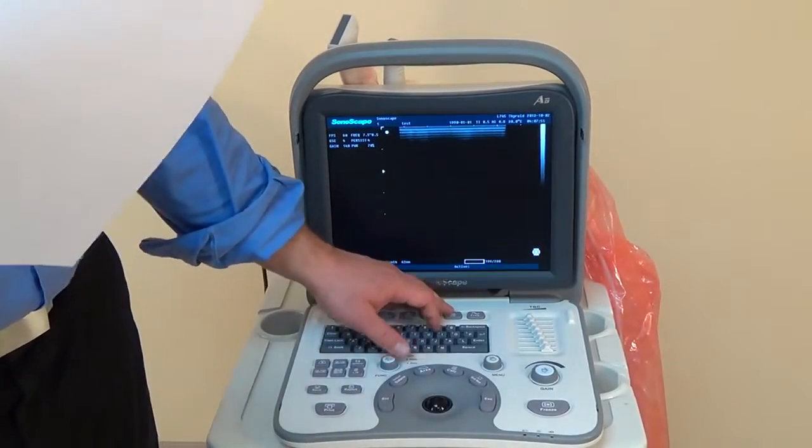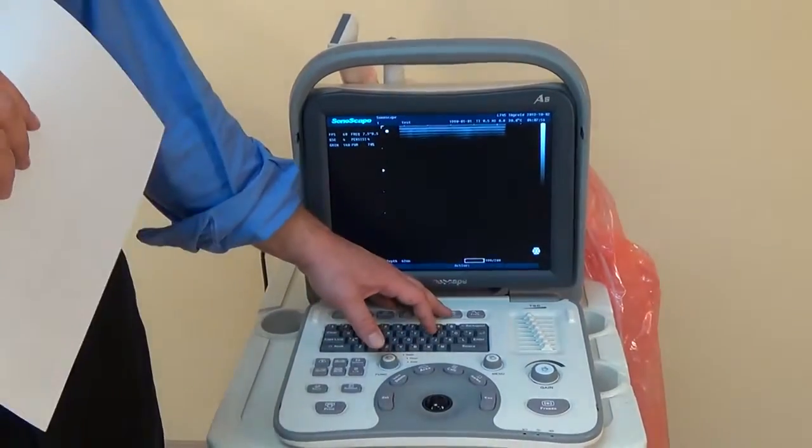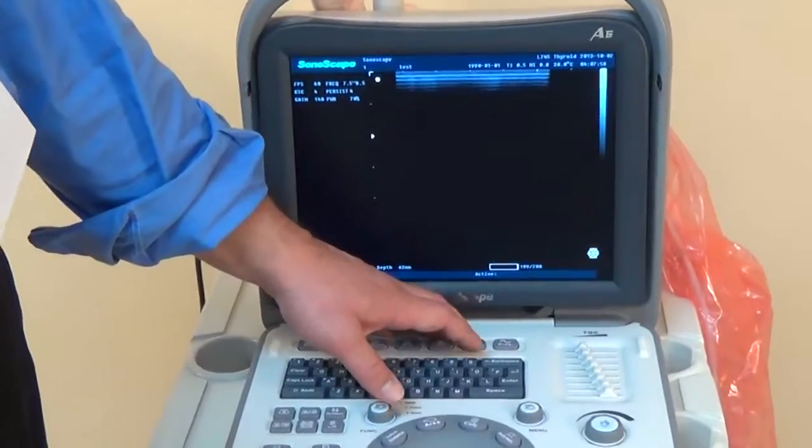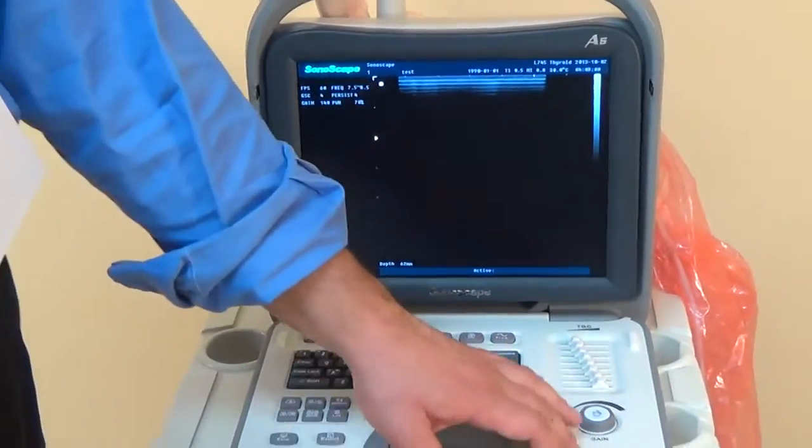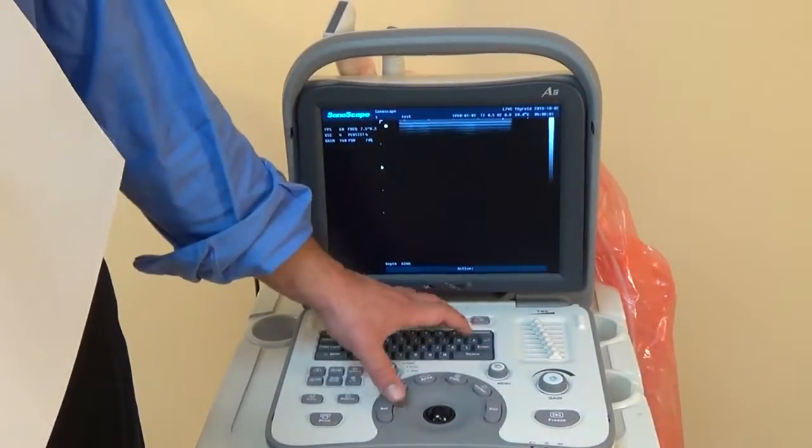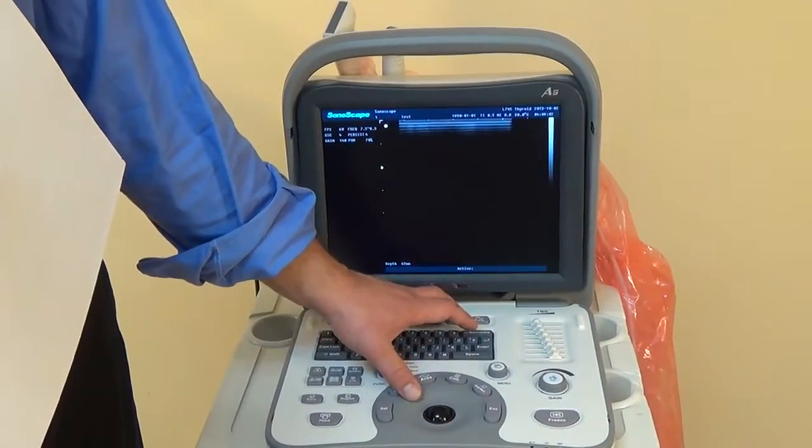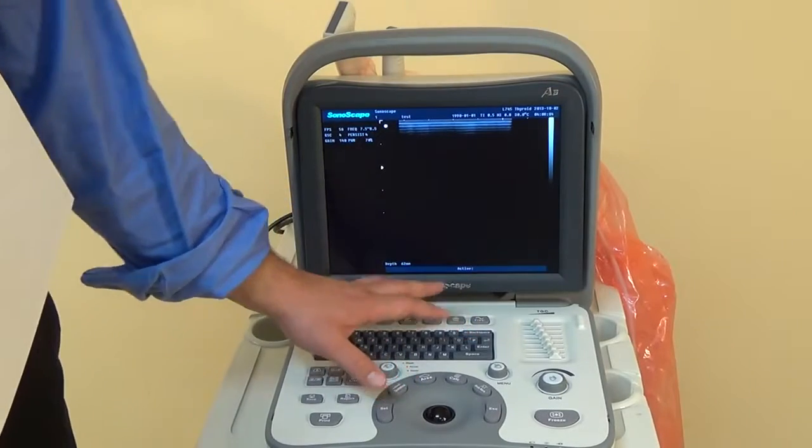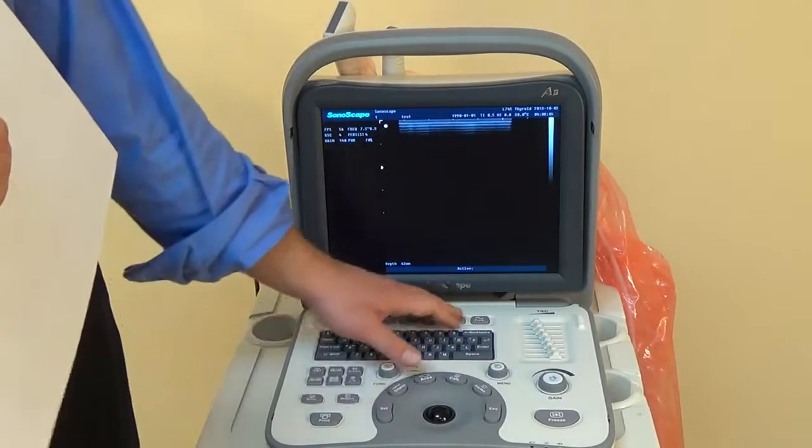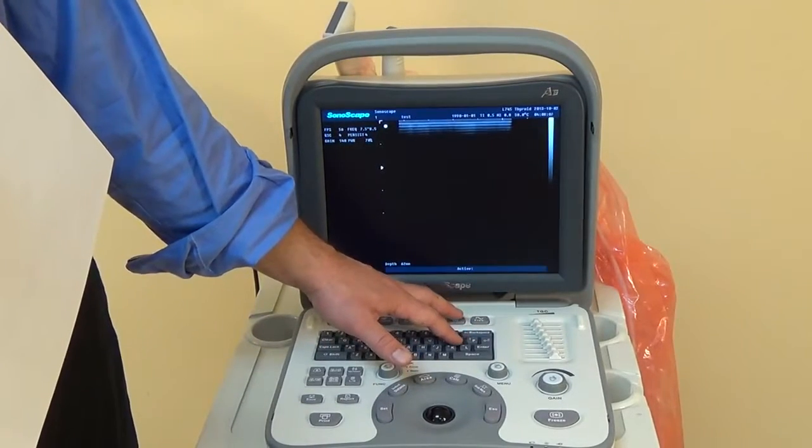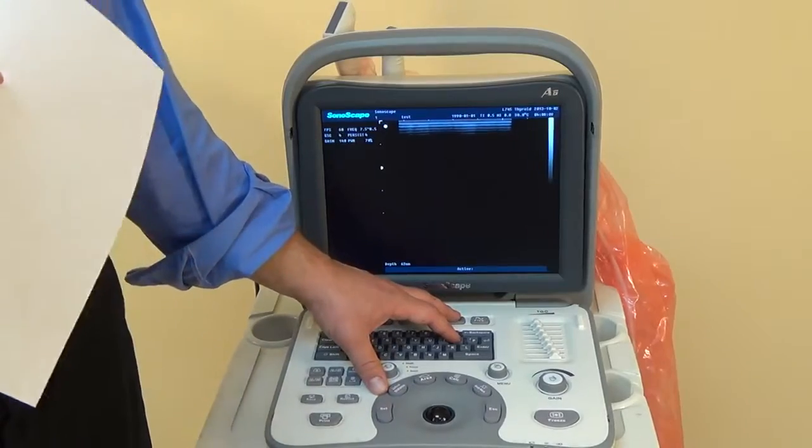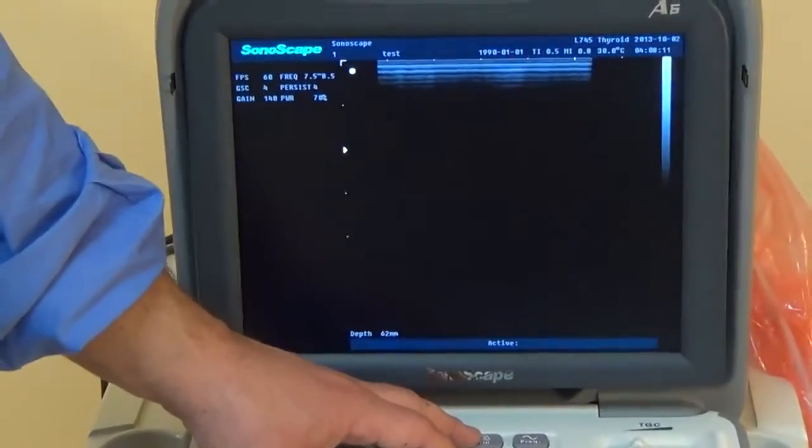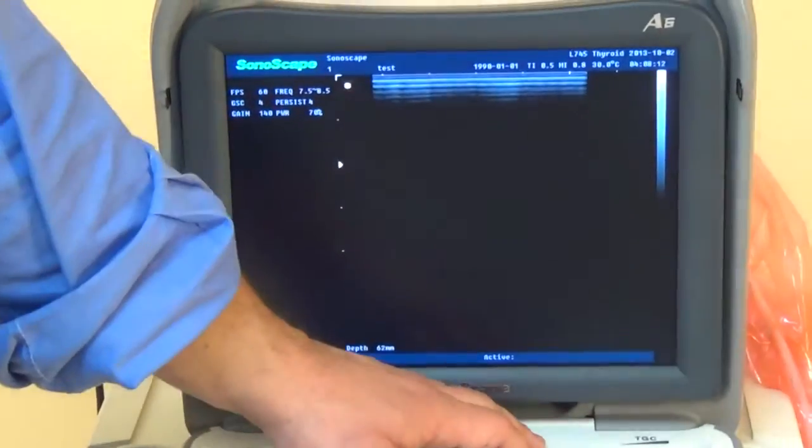The THI button is for tissue harmonics. So that's something that not everybody will be using a lot. It just adjusts the settings on the machine, and that's something that not everybody really messes with, but it's good to know that it's there, just in case you need it.